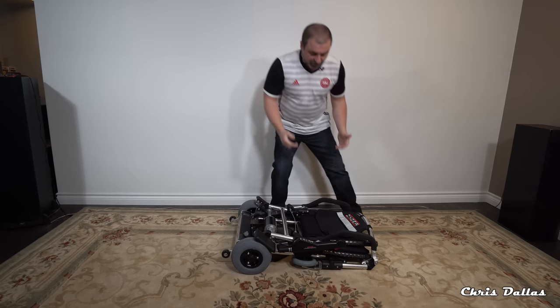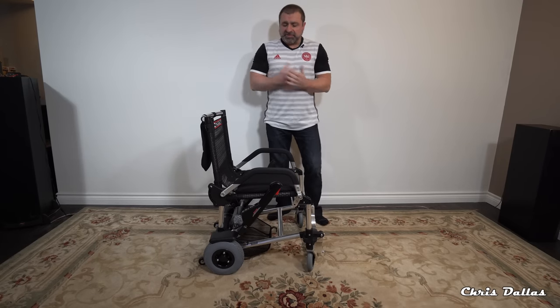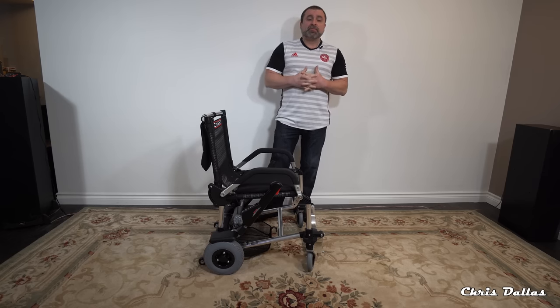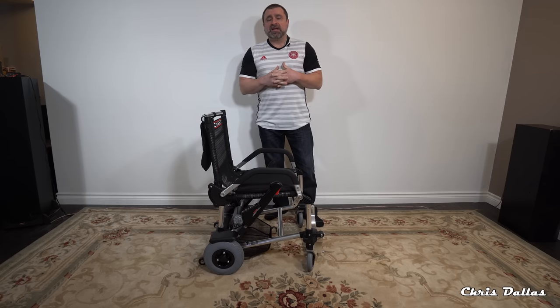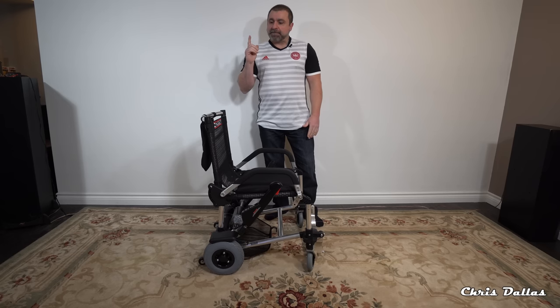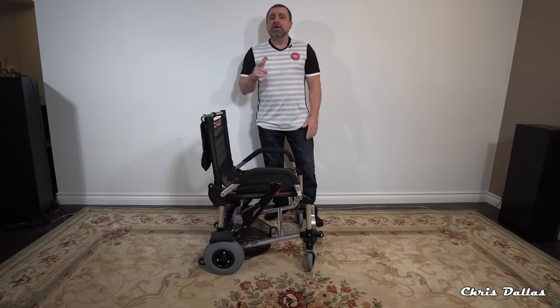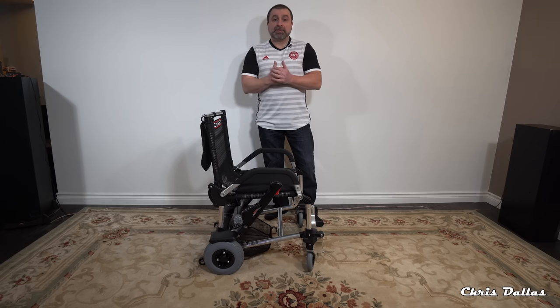It's got a range of about six miles, which is really good with the battery included. You can upgrade the battery to get eight to nine miles, but that battery is not airplane friendly — they won't allow it. This particular battery is under 99 watt-hours, which is the legal limit to allow a battery on an airplane.